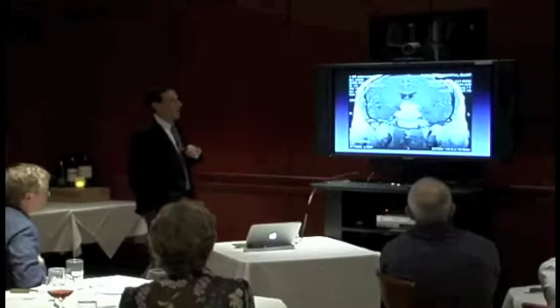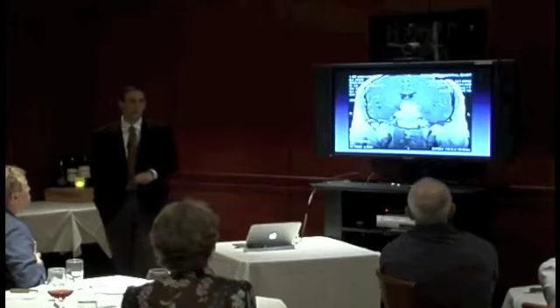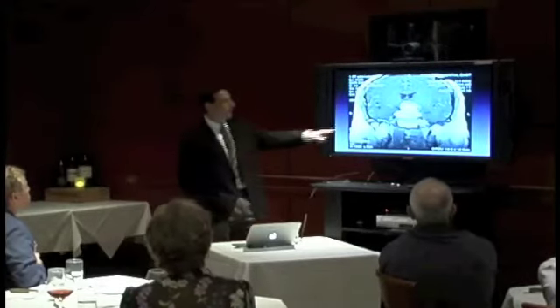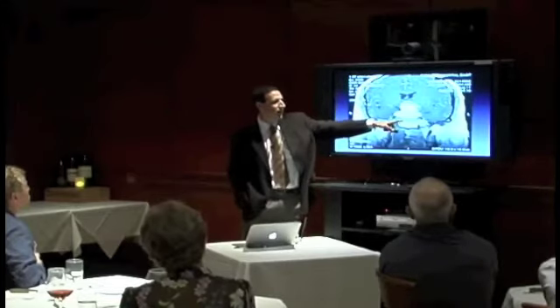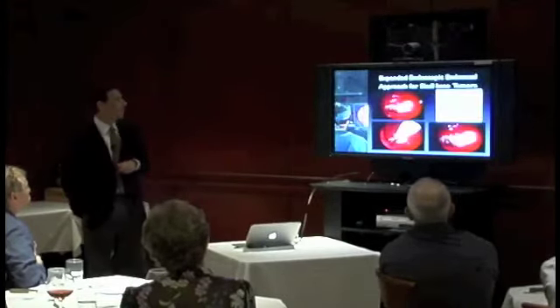What about tumors that kind of go up into the hypothalamus and into the third ventricle? These are very difficult. These are what most people say are incurable brain tumors. Well, if you start and remove a pituitary tumor here, why can't you just continue to go up? And so that's what we've now started to do.